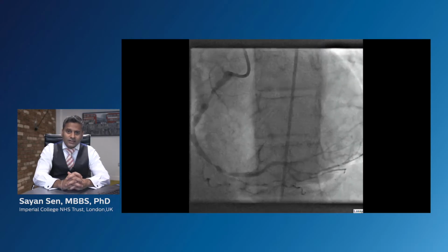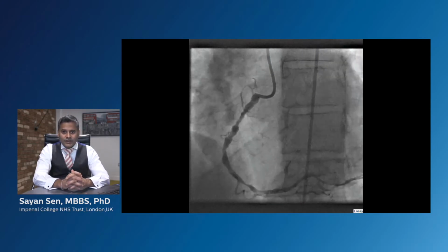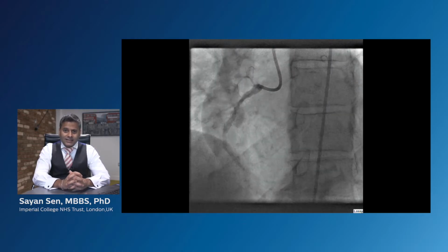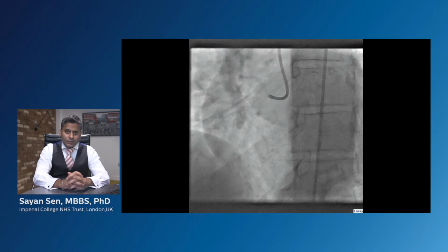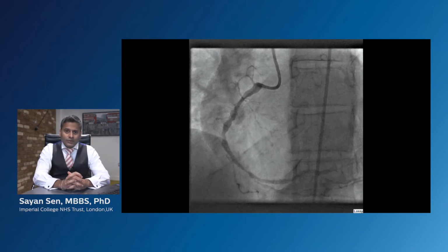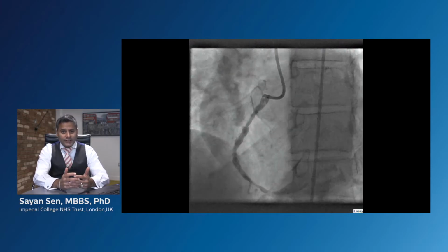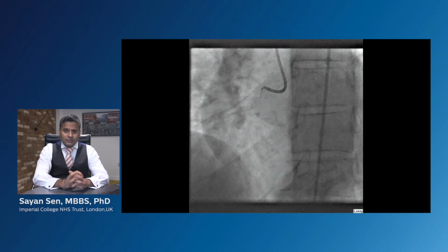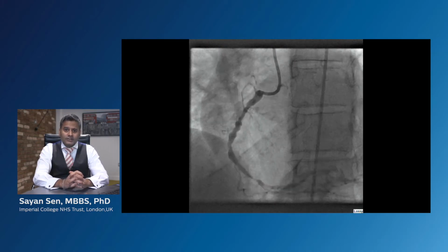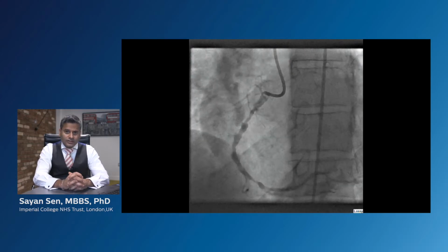On the screen you can see the right coronary artery, which has moderate proximal disease with further severe distal disease leading into the PLV and PDA branch. We were unclear whether or not we wanted to treat the proximal segment of this vessel, but were very clear in our minds by looking at the angiogram that we had to treat the distal lesion from the main branch into the PLV. In order to guide our intervention, as we routinely do at the Hammersmith, we used iFR co-registration.